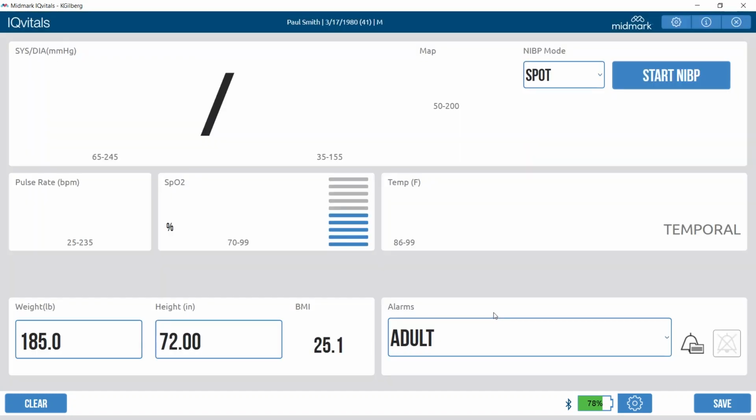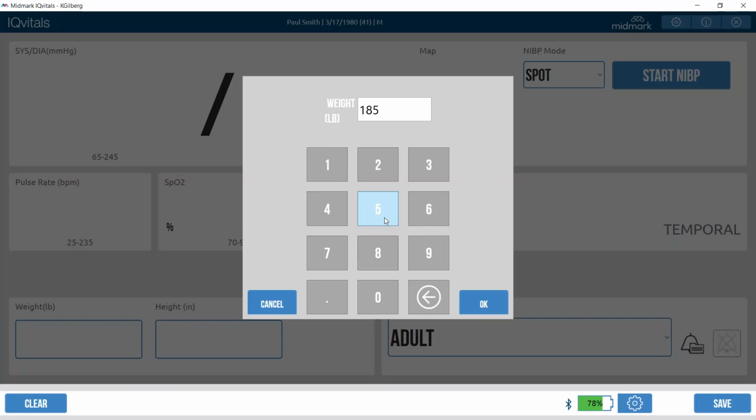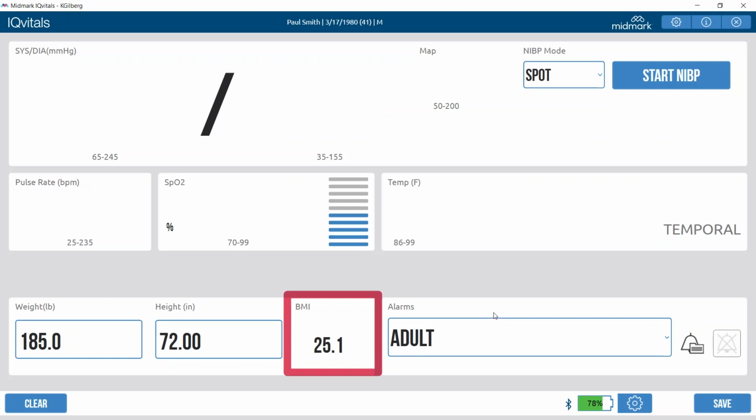Both the weight and height fields have an allowable range. There is a table in the IQvitals Zone User Guide that shows the allowable range for each measurement. BMI is automatically calculated once the height and weight are entered. Both data points must be present in order for the BMI to be displayed.